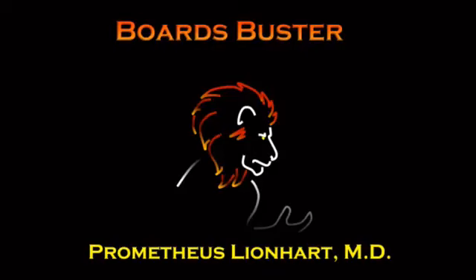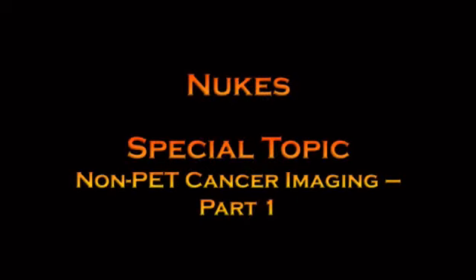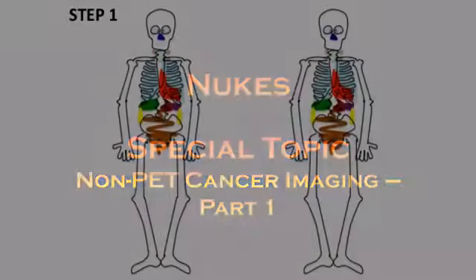All right, so another nukes talk. This is another special topic. This is going to be a two-part talk on non-PET cancer imaging. So usually when you think cancer imaging, you immediately go right to thinking about PET. But I'm going to talk about at least two different exams that are used not infrequently also for cancer imaging. So let's have a look.